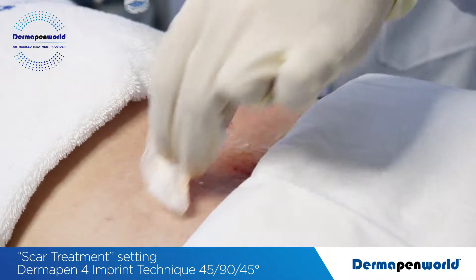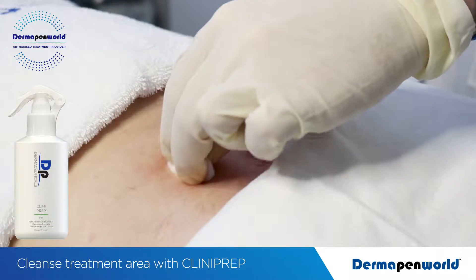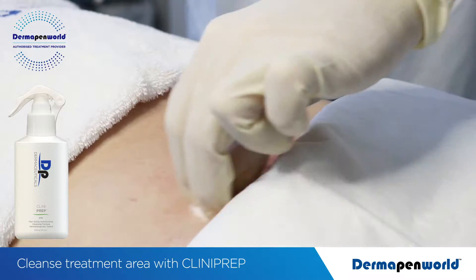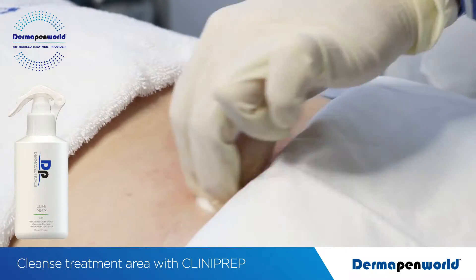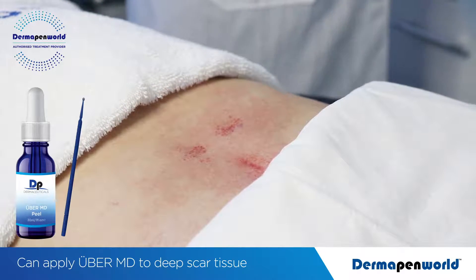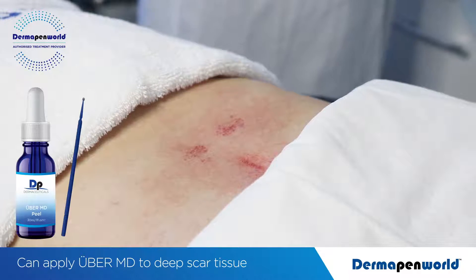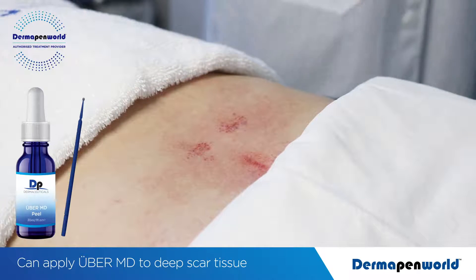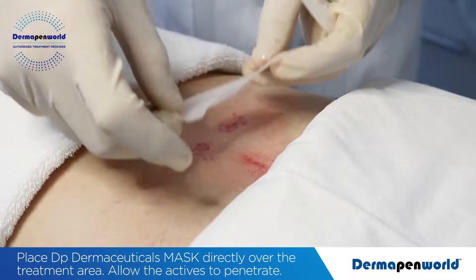The sound of the device still operating means that our needles are at the perfect depth. Apply some Clinoprep solution and remove any post-operative residue. For localised scars, we can use the RER Rapid Eye Restore Mask from DP Dermaceuticals as a localised treatment post-operative.